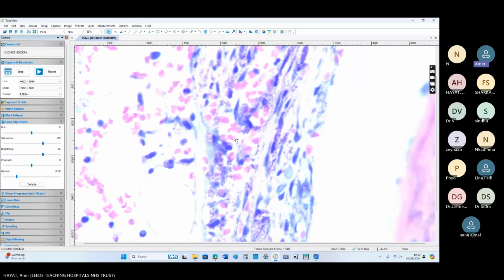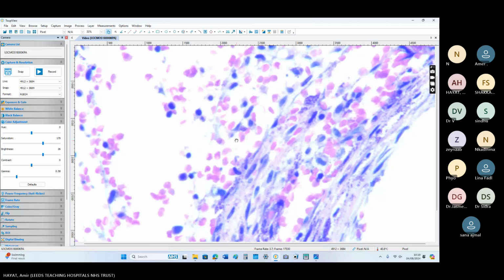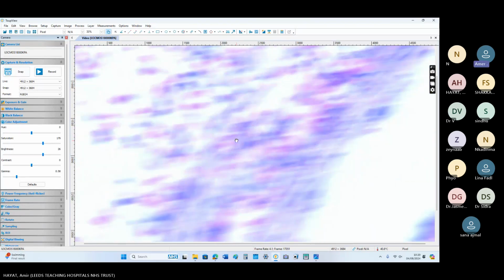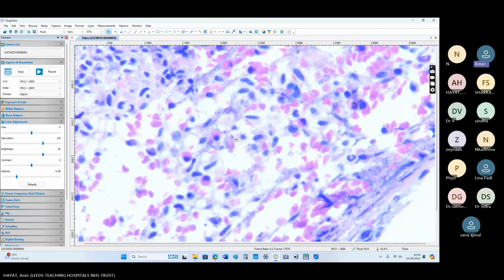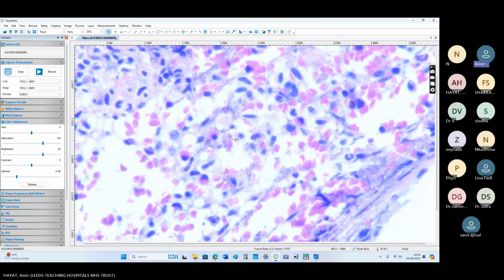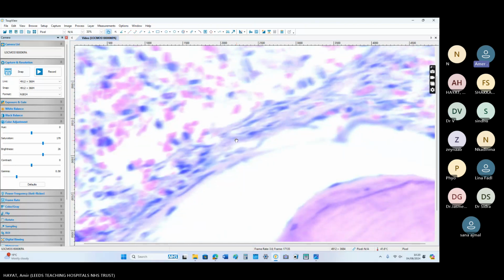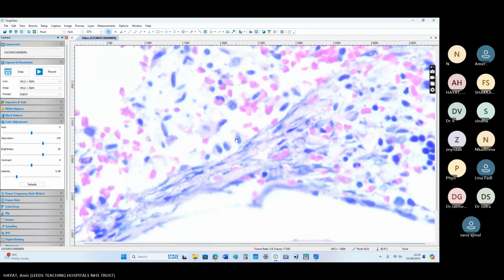This is the peritrabecular area. This is the power 50. In between the spaces, the cells are somewhat normal, but near the peritrabecular area, they are having a distinct structure. Yes, it's an altered background structure.